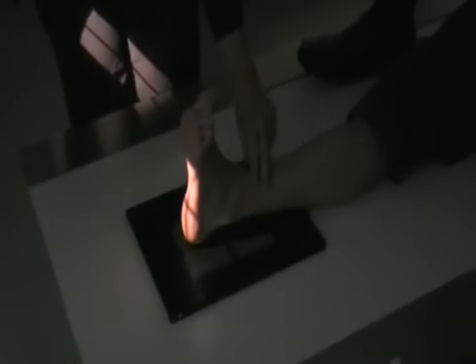Our tube is going to be angled 40 degrees towards the heel. Our central ray is going to enter in the area of the base of the third metatarsal. And then just collimate down.